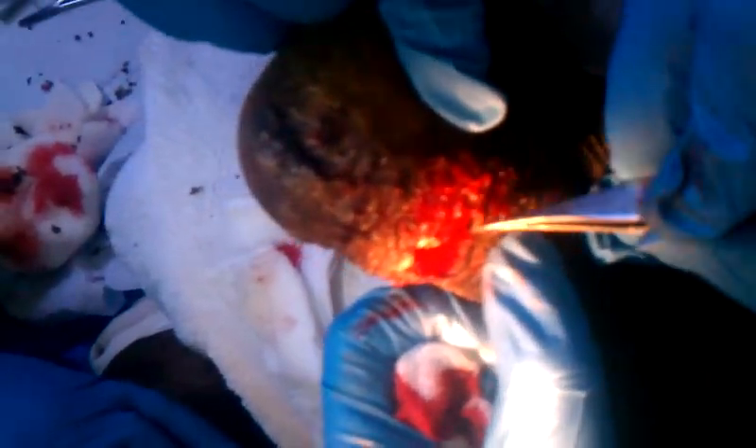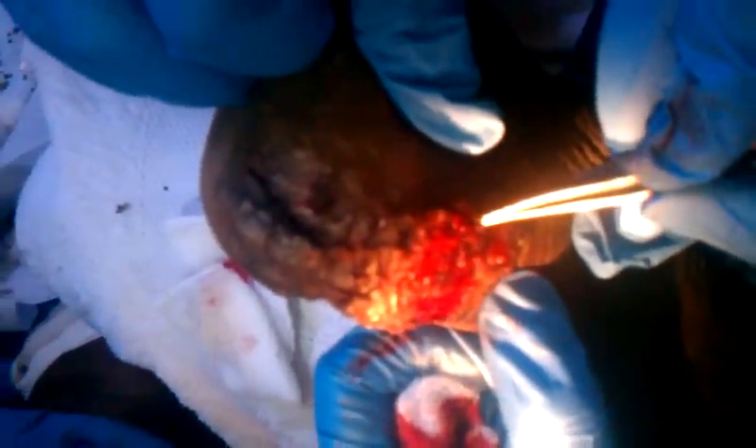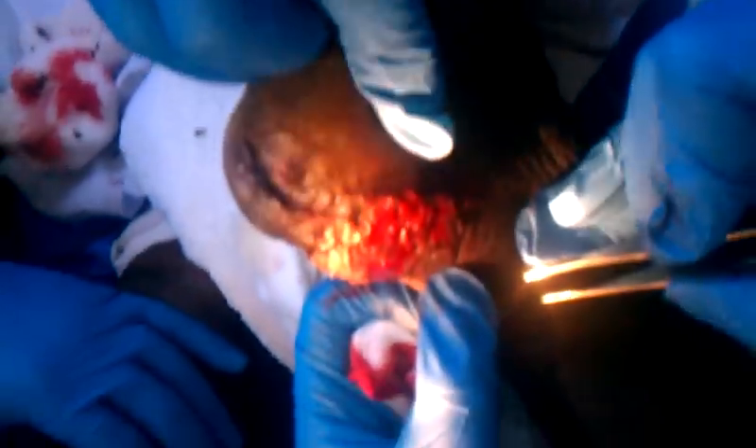Come down to this angle — make sure you're getting that. You see those holes? I'll point to it. Crevice here and here is another crevice right in here and we got another one right in there. So, that's what these sand fleas are looking like.